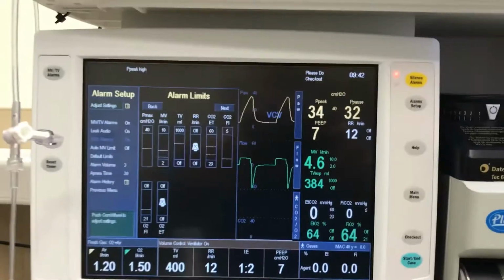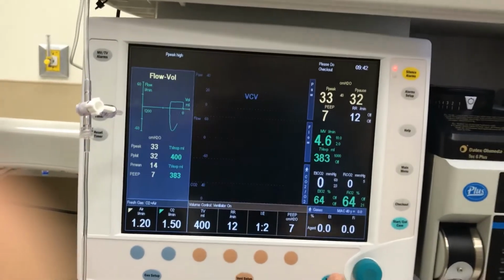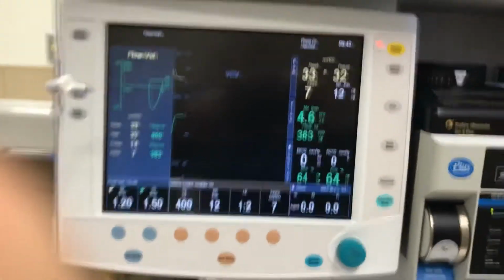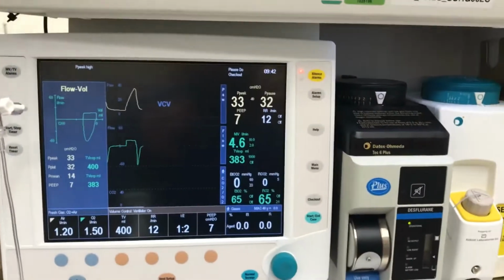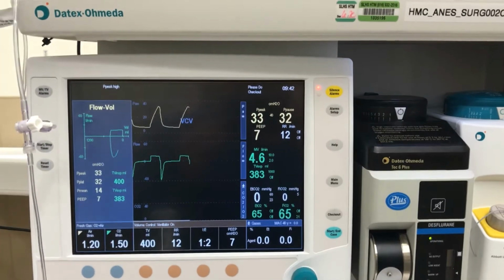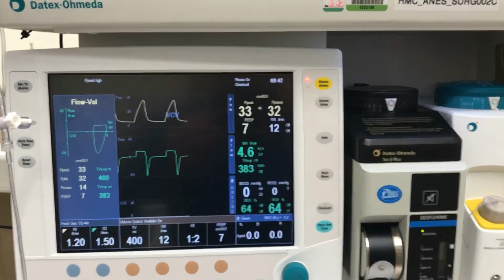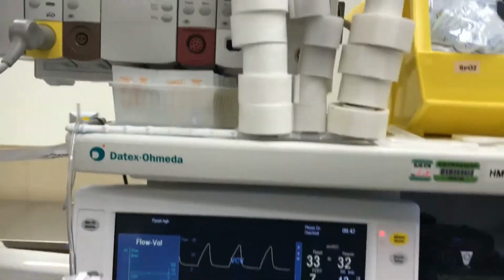In the GE Advanced, as I'm showing you, all the gas monitoring is integral using the gas sampling line. When we go see the Draeger Fabius anesthesia machines at right, we will see that they have a standalone gas sampling that goes into the Philips monitor.